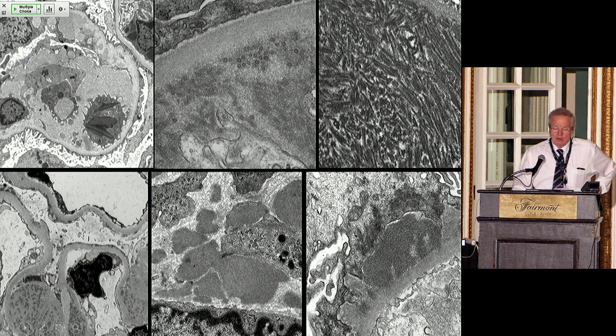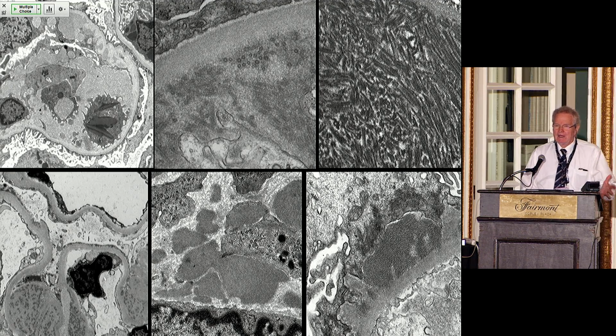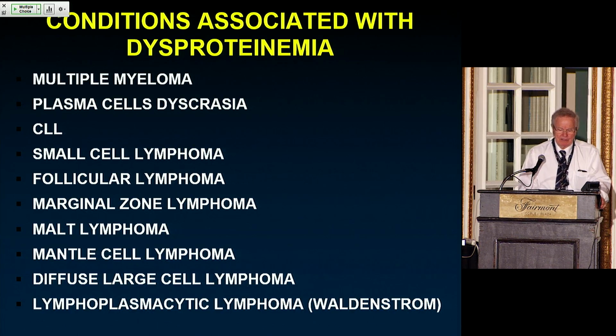Sometimes you see tubular structures in these deposits. Sometimes they are organized, almost like fibrin gets organized. Sometimes they are even subepithelial. Sometimes they organize inside inflammatory cells in the form of crystals. So these paraproteins can fold in very pathologic ways, giving you substructures within these deposits.